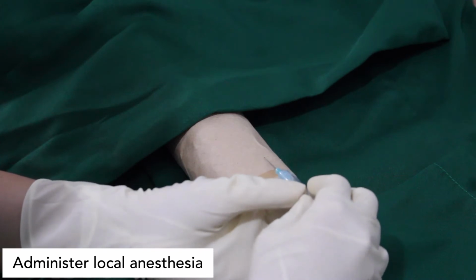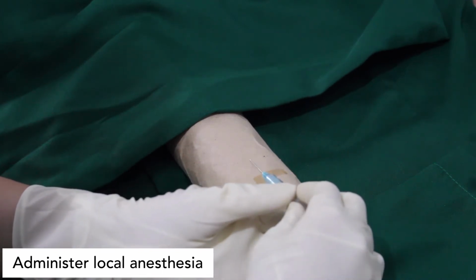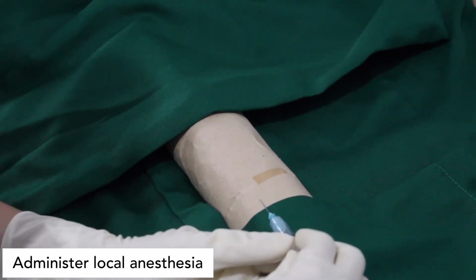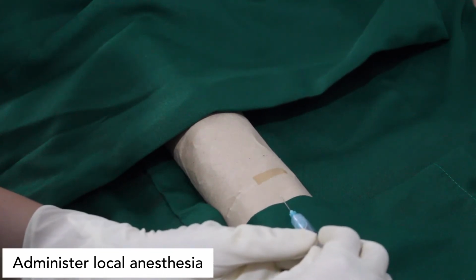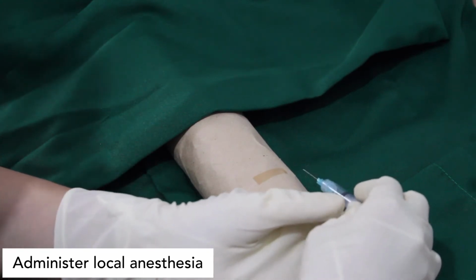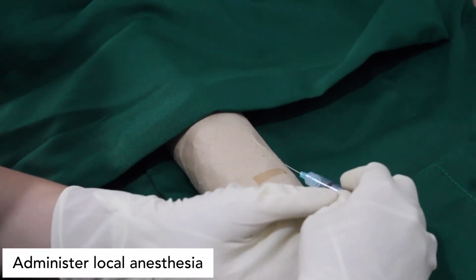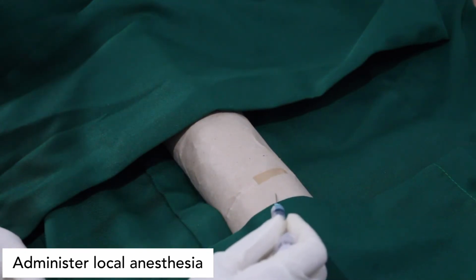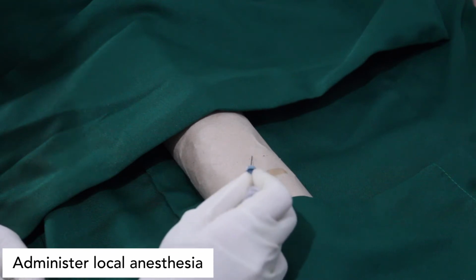For the administration of anesthesia, unless the patient can safely be intubated or the patient can be ventilated with a mask, a tracheostomy should be done under local anesthesia. The skin, soft tissue, and trachea should be infiltrated with local anesthesia with adrenaline before induction.